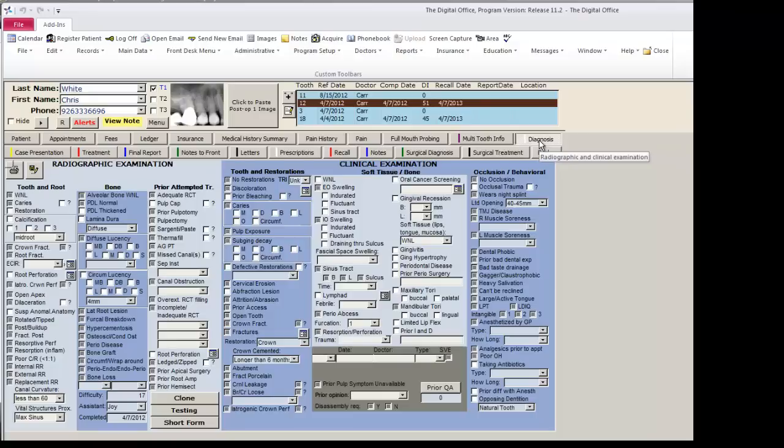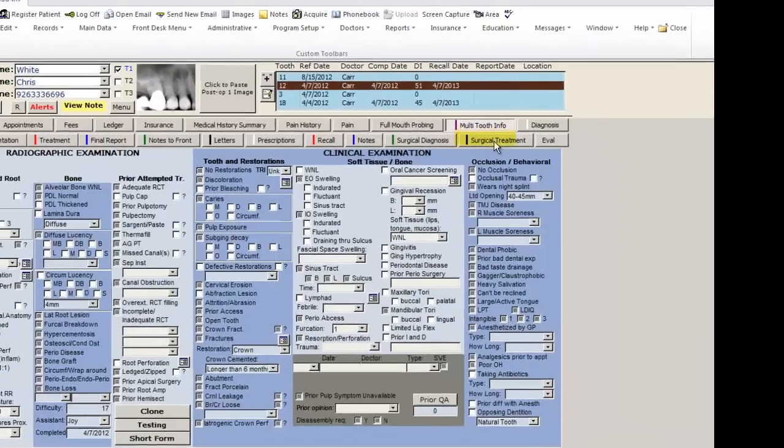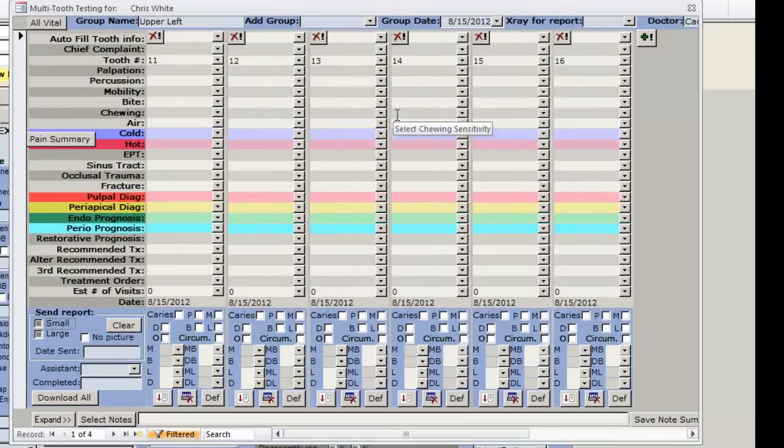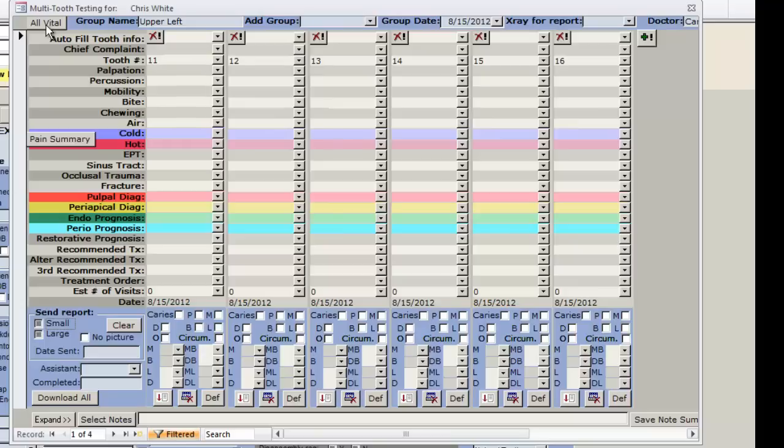The next step in the TDL flow is to do your quadrant testing on the multi-tooth info page. On this page, you will record the results of the testing of the quadrant you are looking at.